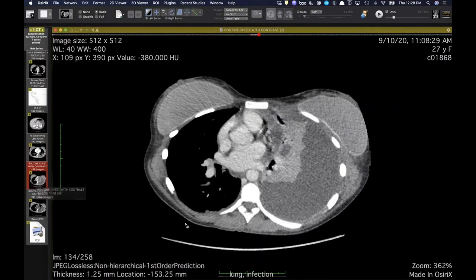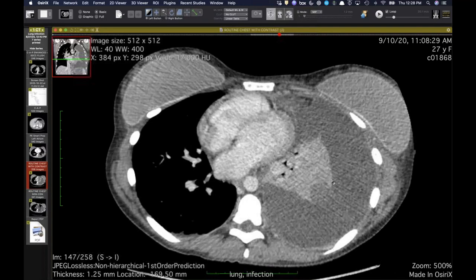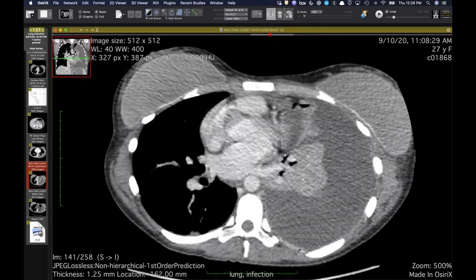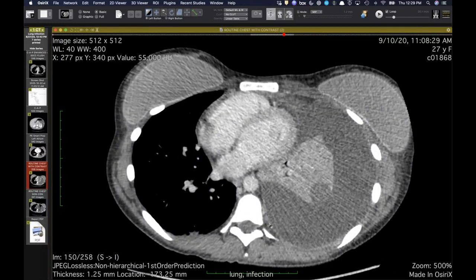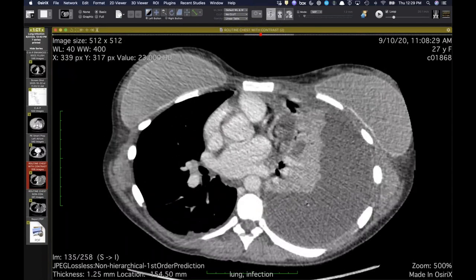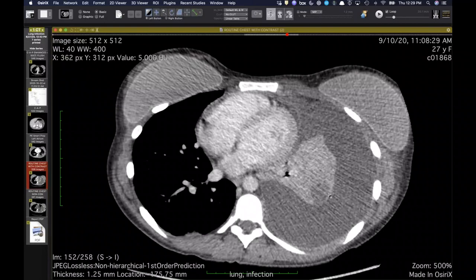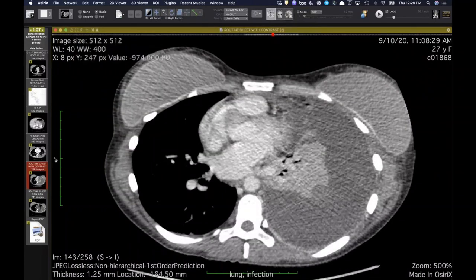with the other ones. And what's really interesting about this is a few days later, it's evolved, and her left lung has collapsed because she now has this developing empyema. You can see there's a lot of pleural thickening. So it's either at least a complicated effusion, if not a frank empyema. And she's developed this little area of necrosis in that.